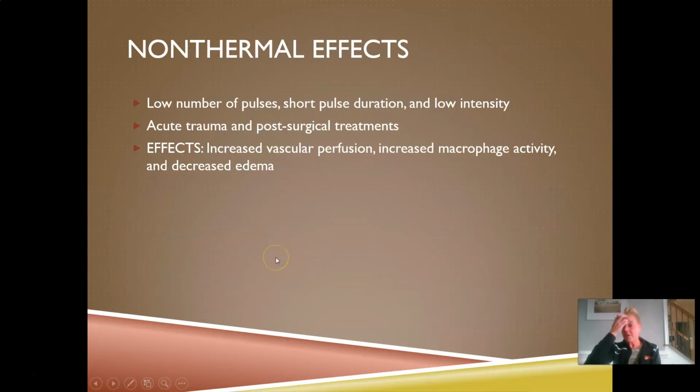The non-thermal effects are similar to the non-thermal effects of ultrasound. It uses a low number of pulses, a short pulse duration, and low intensity. Again, this is good in the acute stage and for post-surgical treatments. The idea behind this is that we're going to increase vascular perfusion, increase macrophage activity, decrease edema, just overall sort of speed along that acute inflammatory process and get the person to proliferation a little bit sooner.